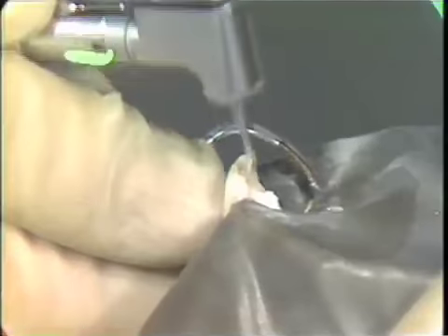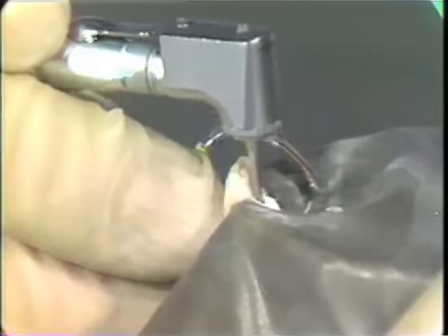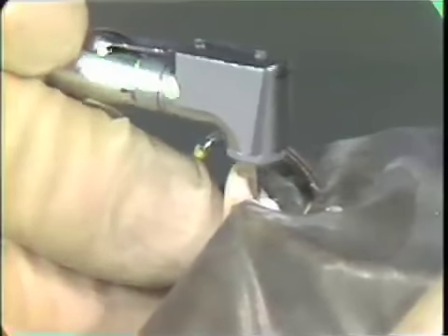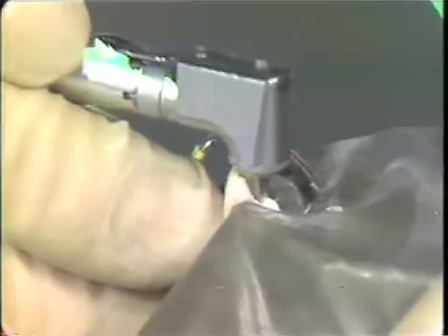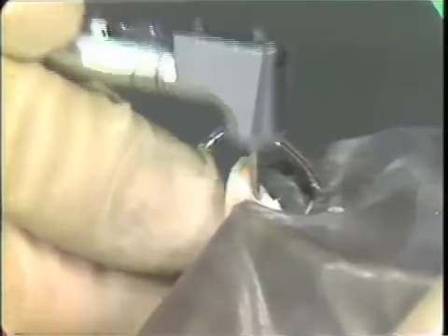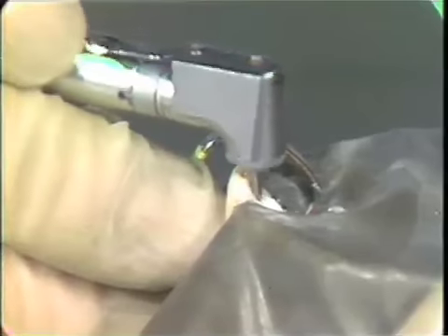I feel a little bit on the lingual, so I go back and unroof. Making sure to keep away from the walls and run the burr only against the roof.